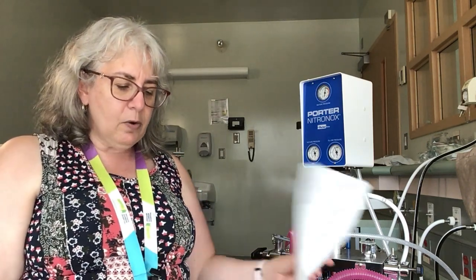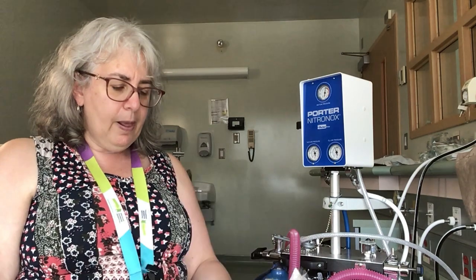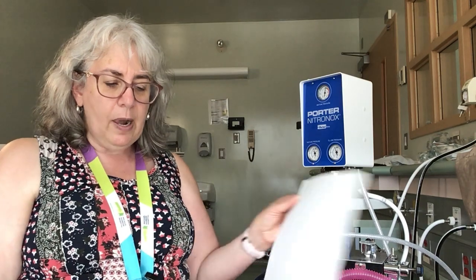If our patient is experiencing any of the following: irregular breathing, involuntary eye movements, gagging, dilated pupils, rigid muscles, or prolonged inspirations, we are going to stop the inhalation and notify the OB and or the family practitioner. Okay, we're going to stop nitrous oxide gas otherwise when there is no longer a patient desire or need, when the epidural anesthesia is initiated, and when there is, obviously, evidence of patient or fetal compromise.